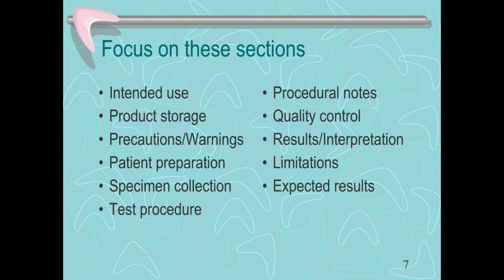The things you're going to look at on that product insert are the intended use. Is it intended to be used at a reference lab, or in an ambulatory setting? How do you store it? Some things have to be refrigerated. Some things have to be protected from light. Some things have to be protected from moisture.